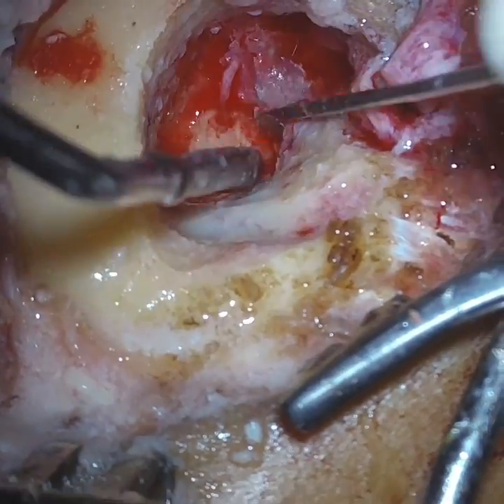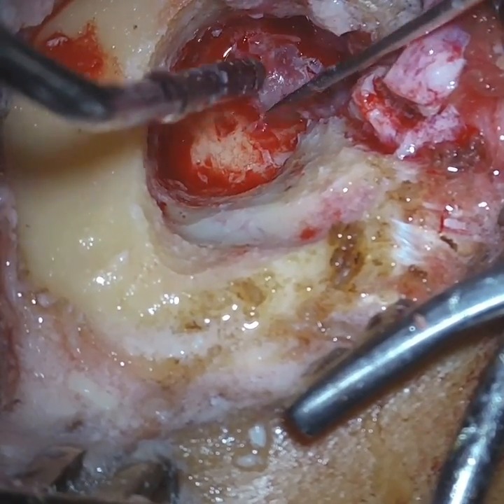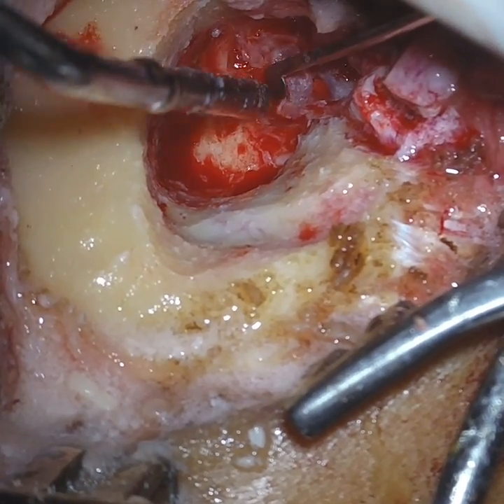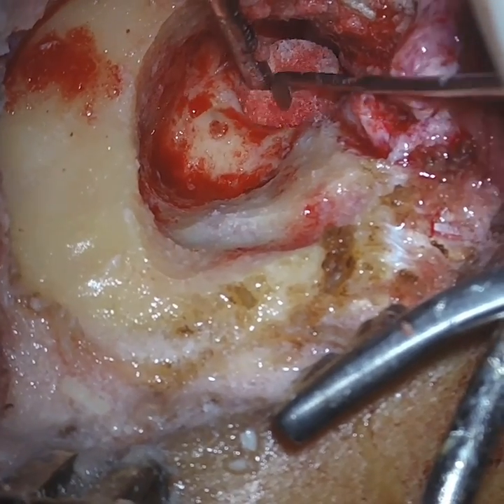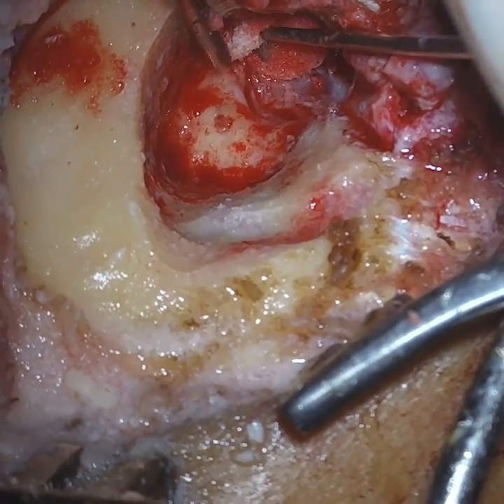So now we are keeping an eye on the fistula. We're not doing anything to the fistula right now. We don't want any exogenous material to go inside the fistulous area, so better to leave the fistula alone as of now, and then start doing the facial ridge area.